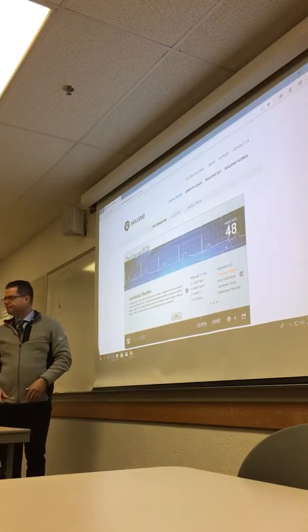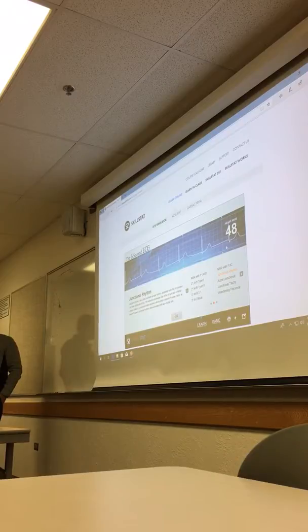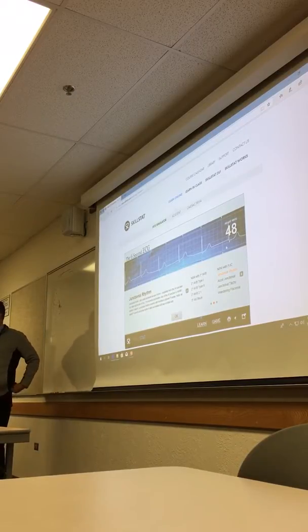Yeah, that makes sense. So it's where you're looking at it. And yes, your question is right. It is always going to be junctional because you have a narrow QRS. Your QRS is normal and your rate is a junctional rate.